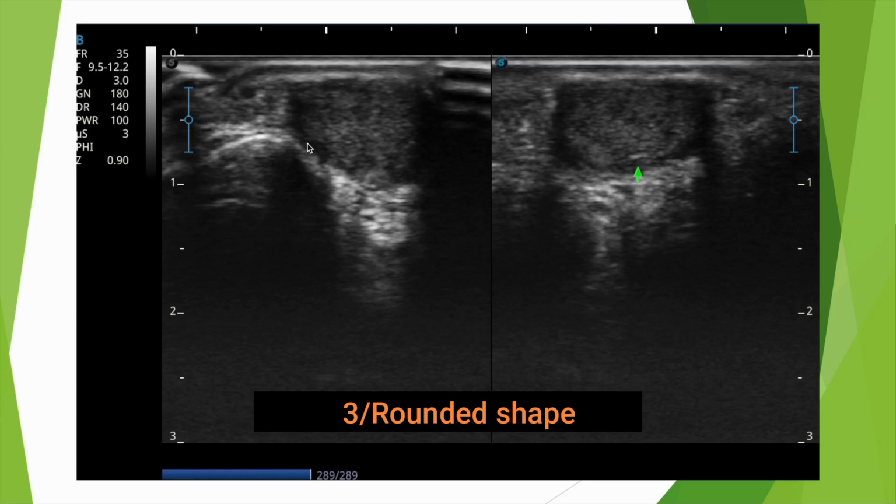If in one direction you have something round and in the other direction you have something long, then it's not a cyst. If we're talking about the breast, it could be a galactophoritis. If it's in a limb, it could be a thrombophlebitis. And yes, you could mistake something for a cyst and get confused if you only take one scan plane. So always, always, always make at least two scan planes. What I call the double grid, transverse and sagittal.